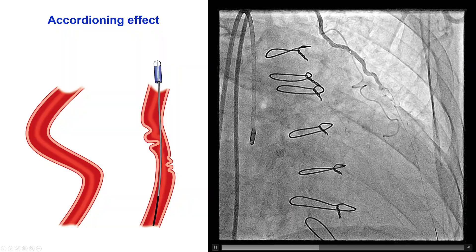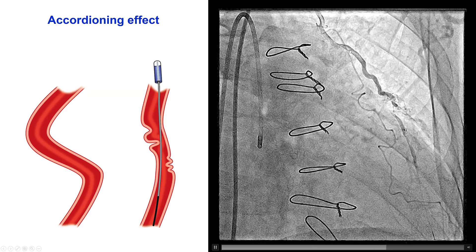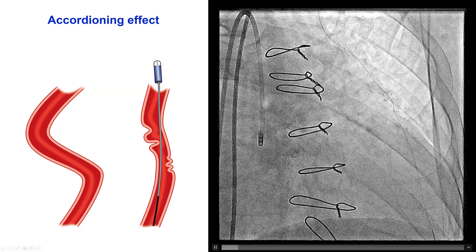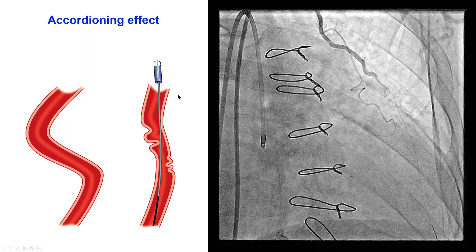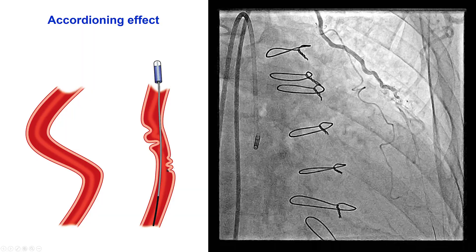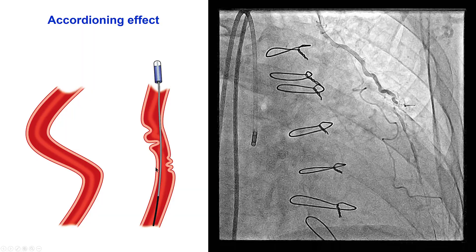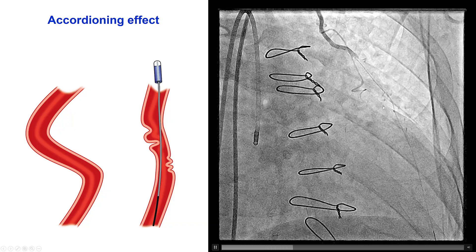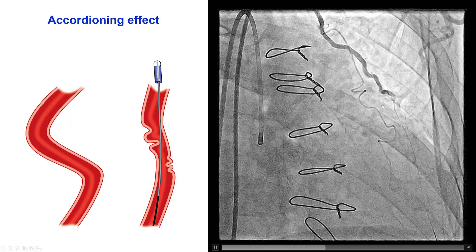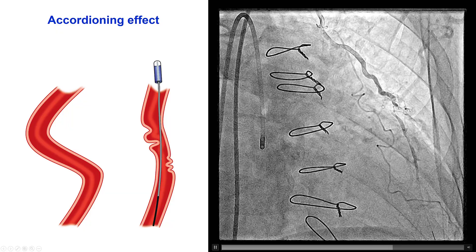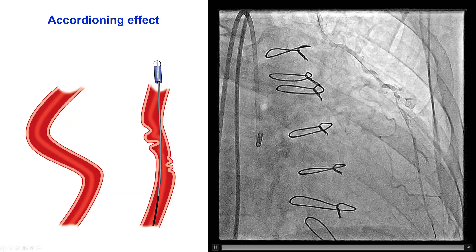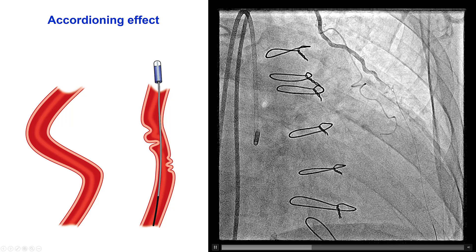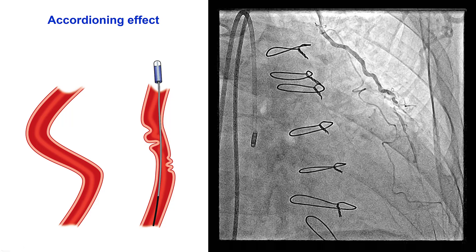However — and this is one of the known problems when performing PCI in LIMA — straightening of the LIMA from the guide wire did cause this accordioning effect or pseudo-lesion effect. We can see that flow is much worse now, and the patient actually did have some chest discomfort and EKG changes. So we knew this was not a position we could maintain for a long period of time, and we had to move fairly quickly.